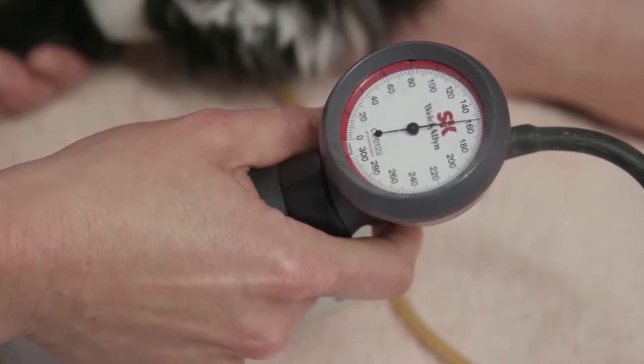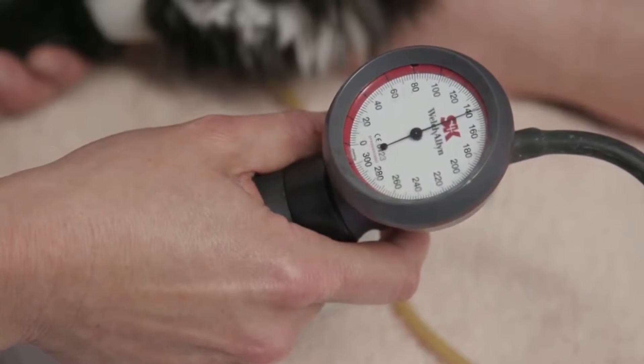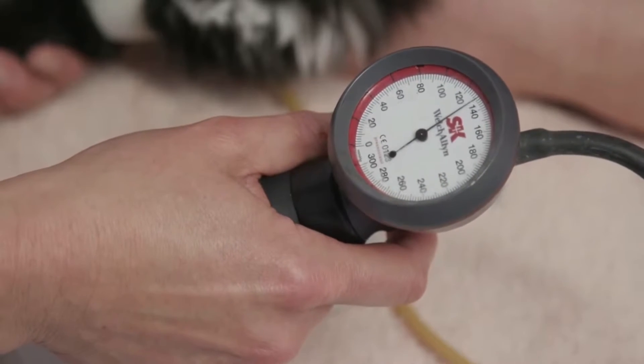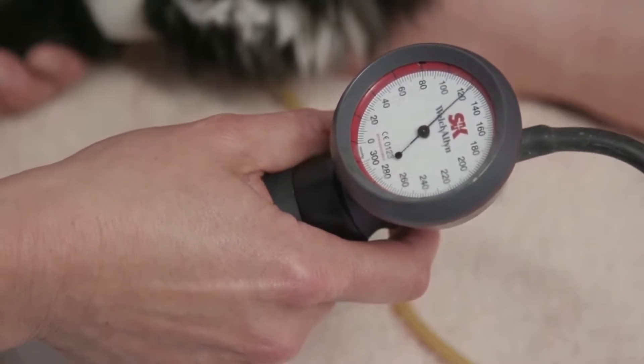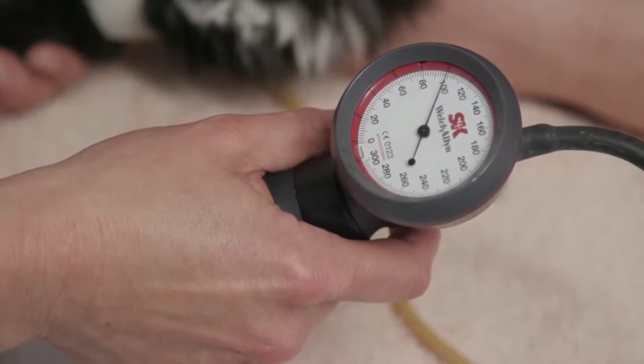If you inflate a little bit above that point, and then slowly start to deflate that cuff, all the time looking at your pressure gauge, listen very carefully for the point where the pulse is first clearly audible — and that is your systolic blood pressure reading.